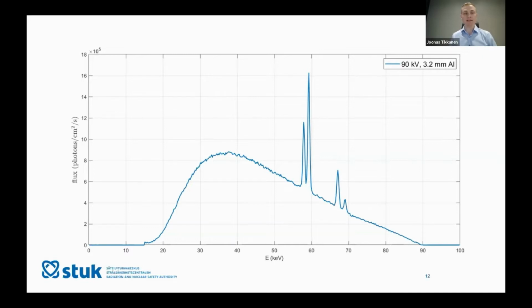But one thing about these X-ray spectra is that these are continuous spectra. So we are getting photons with all the energies inside the anode from 0 to the maximum energy, but outside the anode practically from some minimum energy up to the tube voltage, so to speak.